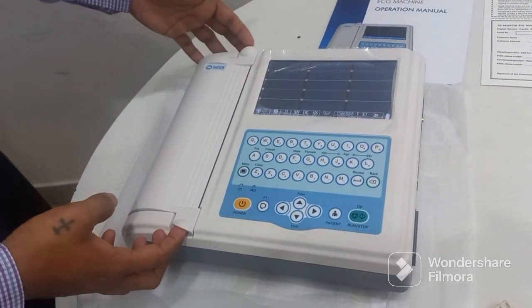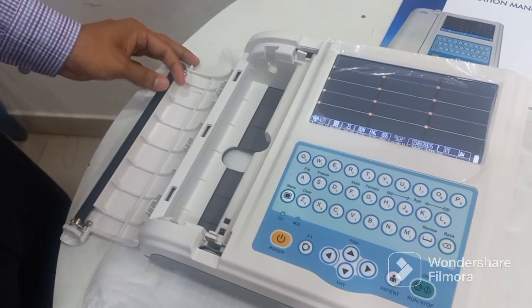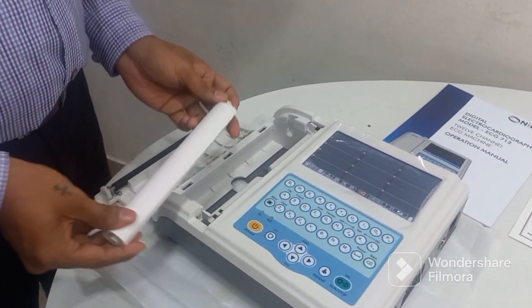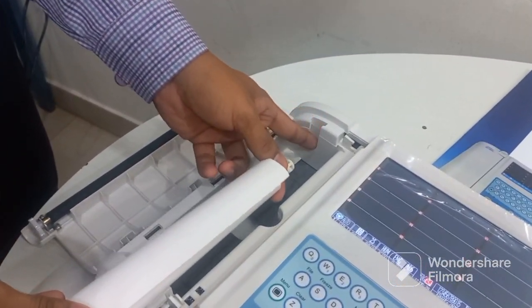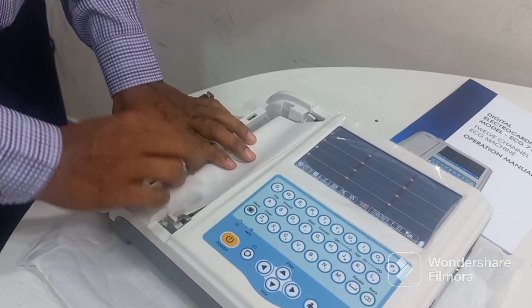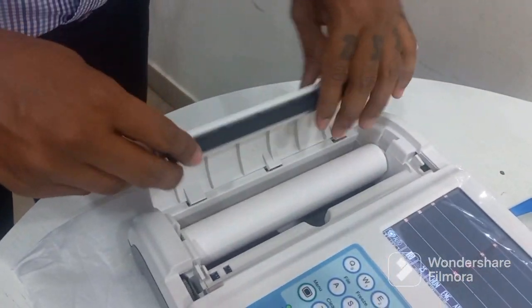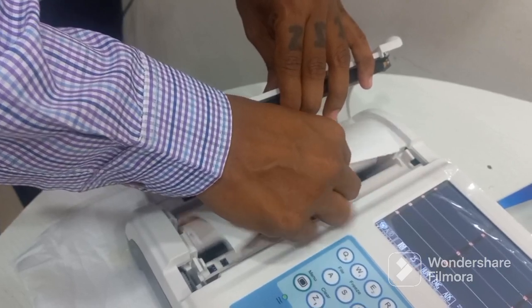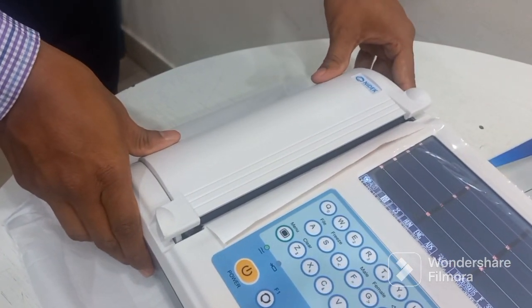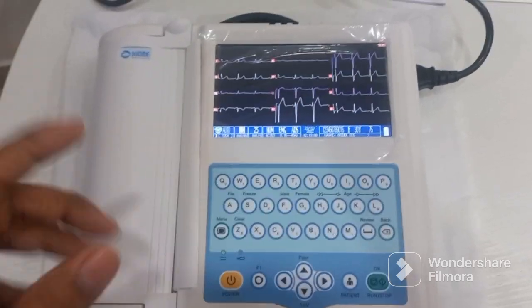Now we'll feed the paper inside the machine. This is the area where you put your fingers and lift it up — once you lift it up the door will open. You get a ruler along with the machine. Put it inside the paper roll, then match the roll on both sides. Once you feed it inside it will go in, align the paper and match the three notches.